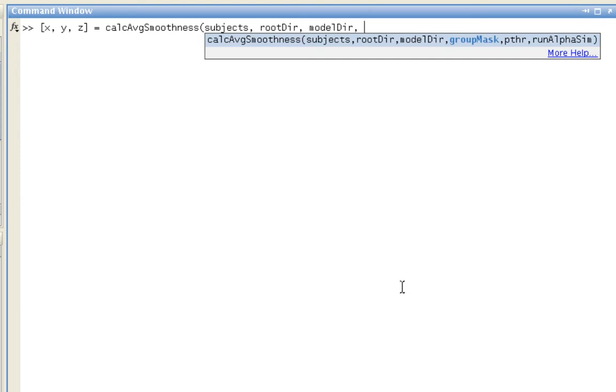Group mask is a path pointing towards where you have a group mask that was estimated from a second-level analysis. In other words, an intersection of all the individual subjects' masks. I already have that variable set up.